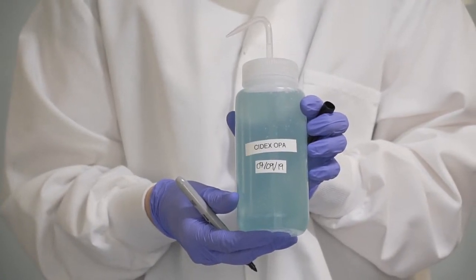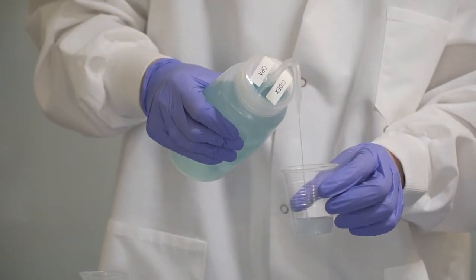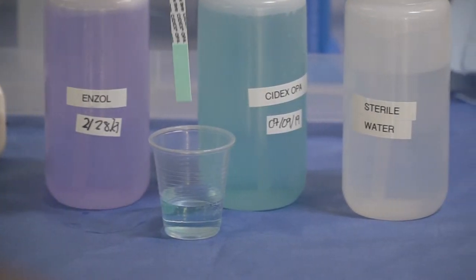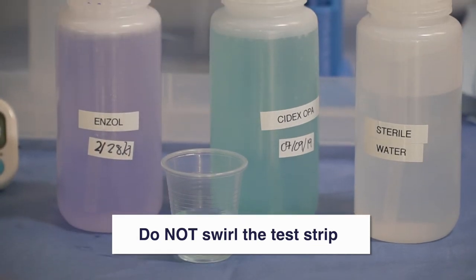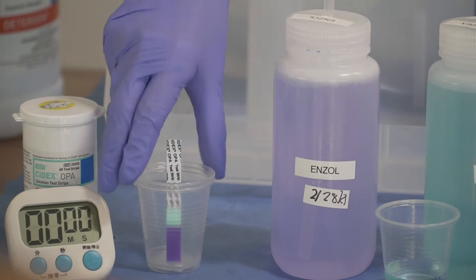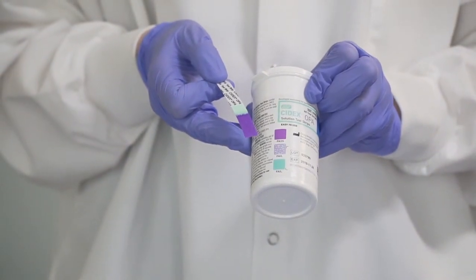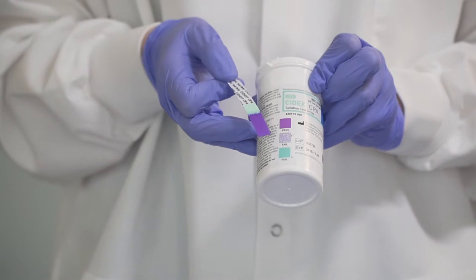You must test the Cydex every day. Pour 3 ounces of Cydex from your squirt bottle into a plastic cup. Open a box of Cydex test strips and remove one test strip, ensuring your hands are dry. Dunk the test strip for one second into the cup of Cydex — do not swirl the test strip. Remove the test strip and place it in another plastic cup. Set the timer for 90 seconds. After 90 seconds, compare the test strip to the chart on the side of the container. If the test strip is purple, your Cydex is good. If the test strip appears blue or patchy, your Cydex is no longer good and will need to be replaced.